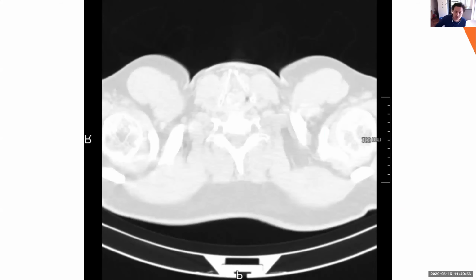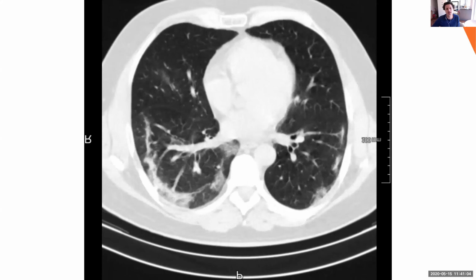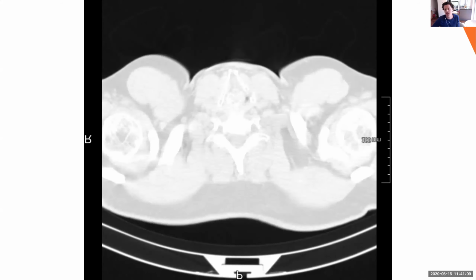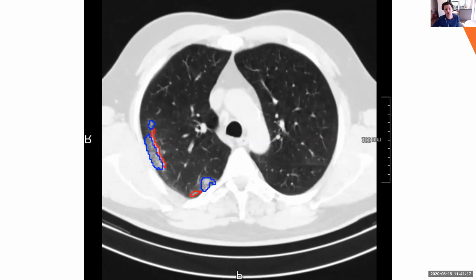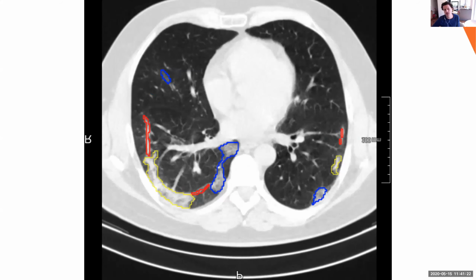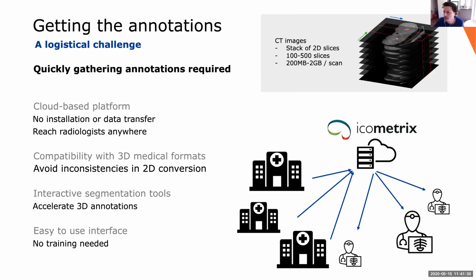So first, multi-class segmentation. There are already a lot of images shown, but I'll go through them again. This is a subsampled image of a CT, and as I scroll through this image, we see the patterns appearing, so it's inherently a 3D image. What we want is to identify those patterns by closely delineating them, but also to characterize them, so we know which finding is which, and that's the colors in this image. We want to do that completely automatically, without any manual intervention. And we want that to be robust, and it has to work for different hospitals and different CT images.